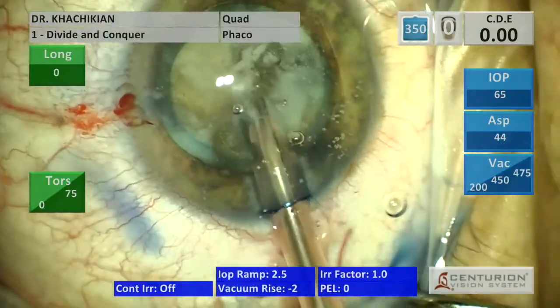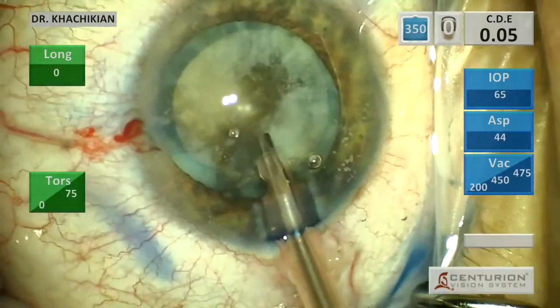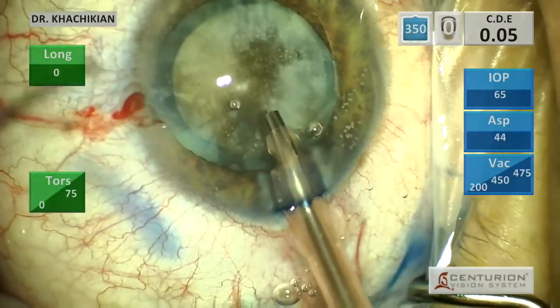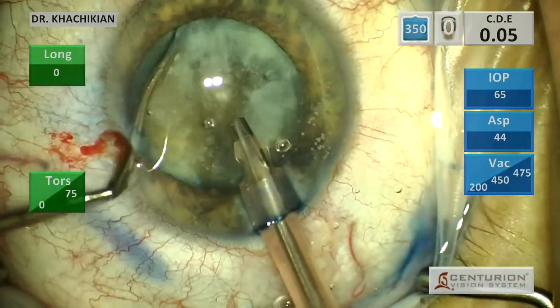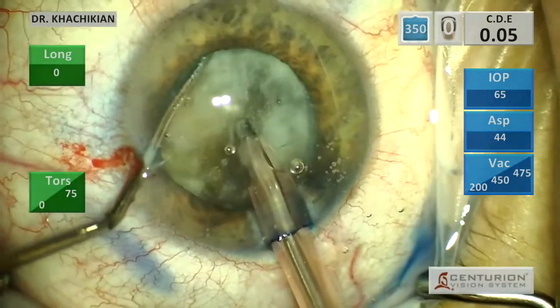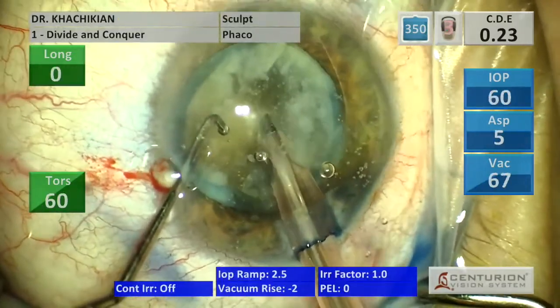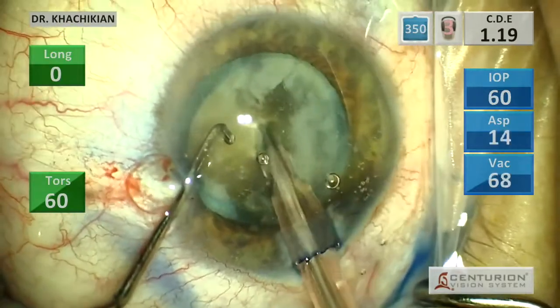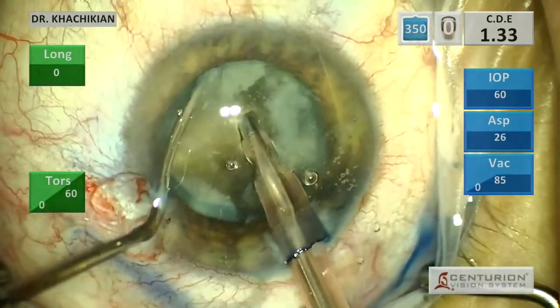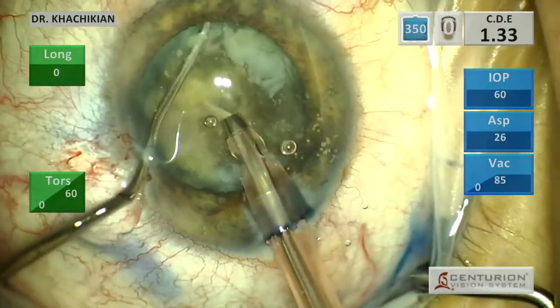We'll initiate with some high vacuum quadrant removal to clear the tip of the phaco handpiece, and then we'll begin our chop. We go straight to chop here because sculpting is going to prove to be kind of ineffectual. It's nice to have a little groove to place your chopper, but clearly sculpting in this nucleus is not going to be the best way to disassemble it.